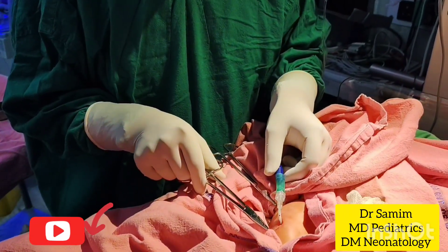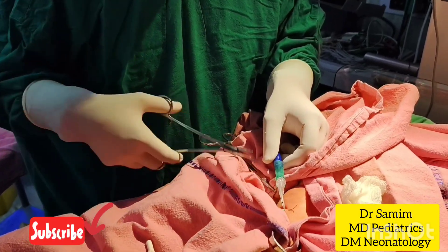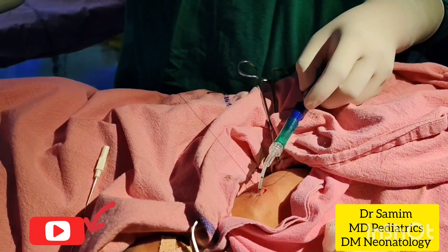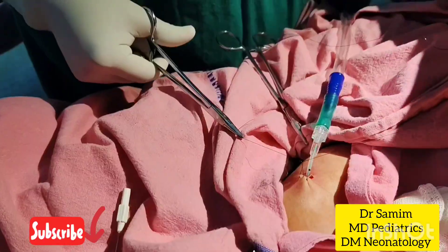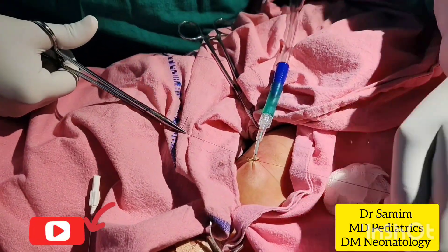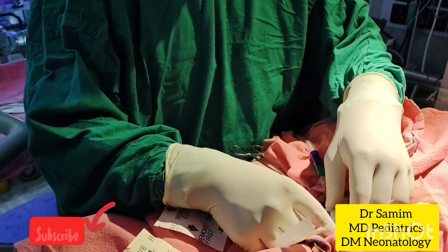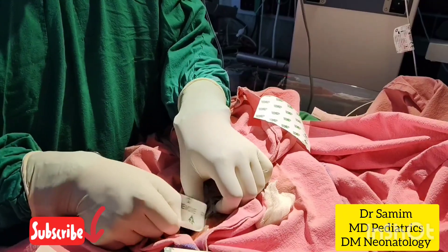Now we have to close and fix the ICD tube entry site by purse string suturing with the help of nylon 3-0 suture materials. To prevent displacement of the tube, we are fixing the tube to the skin with the help of Tegaderm Skin Protective Adhesive followed by Dynoplast.